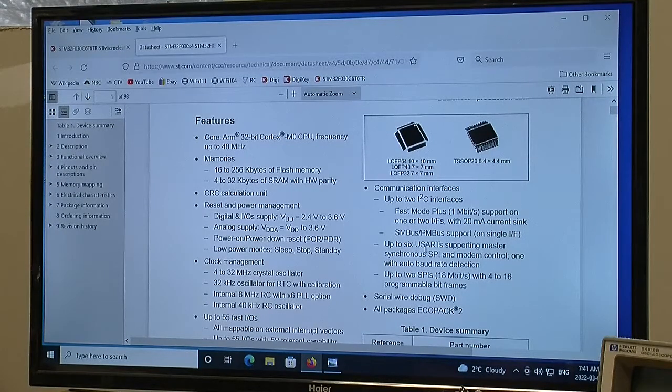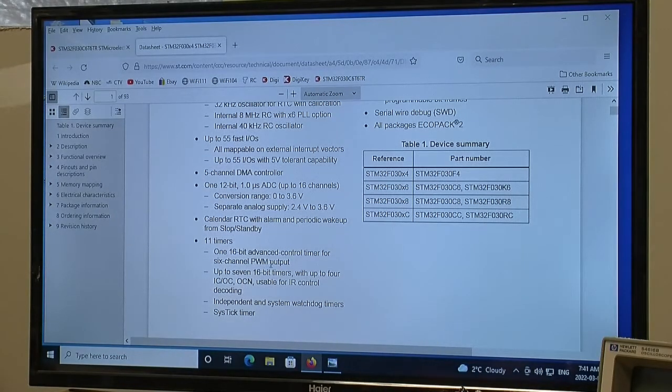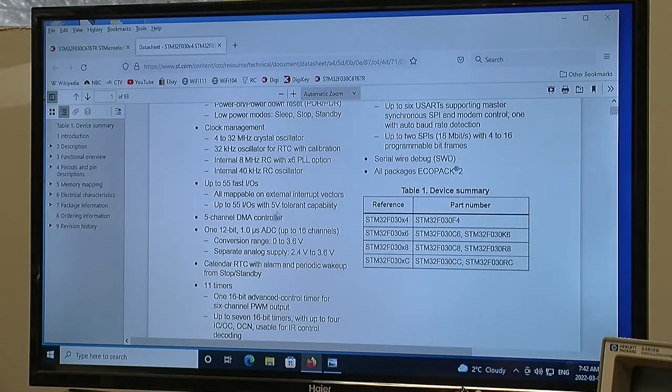A bunch of serial UARTs, SPI, and somewhere, oh yeah, I2C controllers. That would be great to communicate with other devices on the circuit board, probably most notably the sensor in the bullseye of the donut. And somewhere else here I also saw there was a pulse width modulator output that might be used to control the heating voltage on the donut, so with a very efficient form of on-off type control to keep the temperature okay. And there's also an analog to digital converter over here that could be used to measure the temperature.